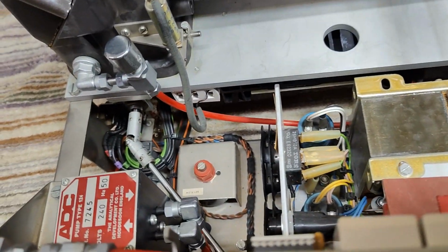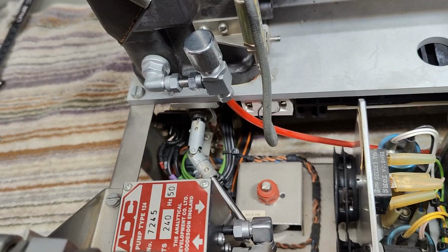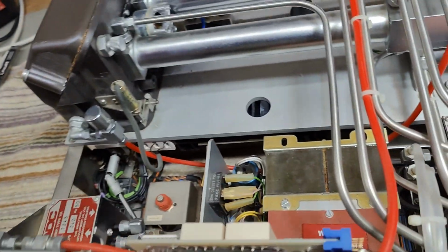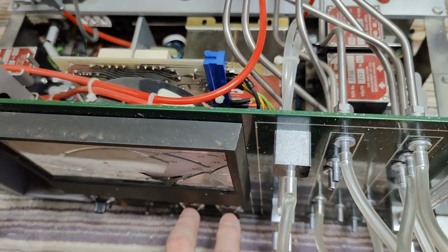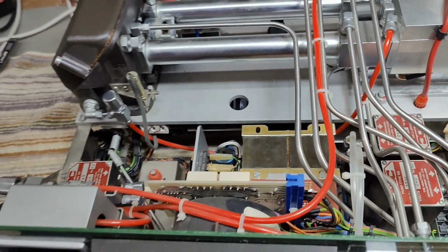See, it goes in here. So this explains why it is so tough to move. I thought there was something wrong with the potentiometer, but it's geared quite a lot. So this is a valve, and the other, okay, those two are potentiometers down here. But definitely, this is going to be interesting.